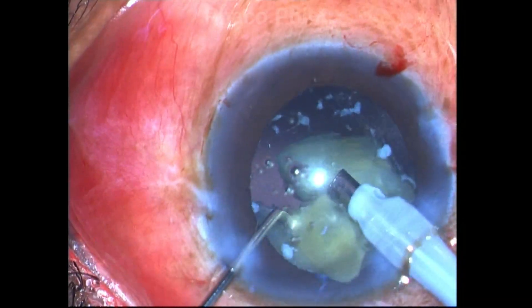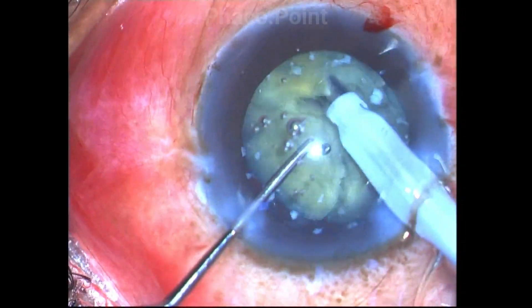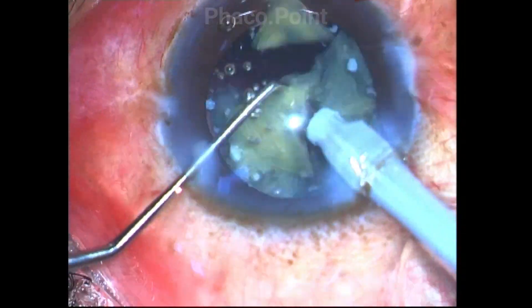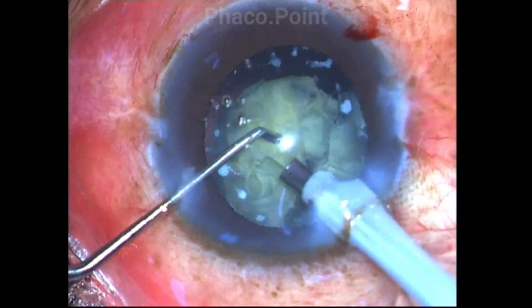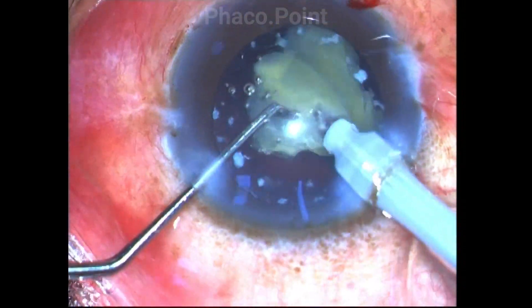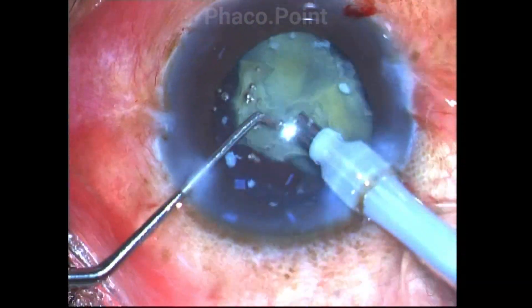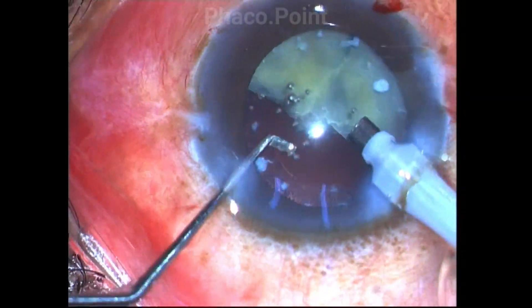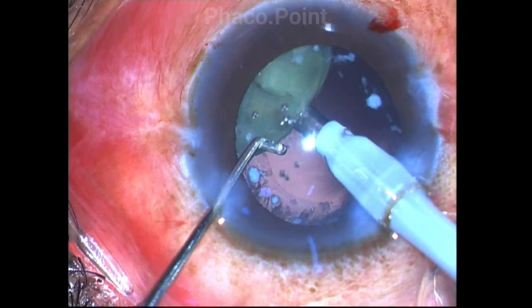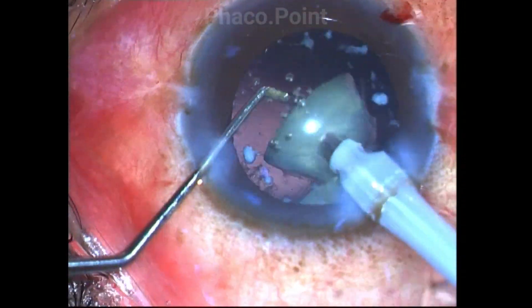Once I have made small enough fragments, even though they seem to be connected, it is still possible to emulsify these fragments safely within the safe zone. Every step and every move should be done with care and caution because inadvertent use of phaco power will cause damage to the posterior capsule. Wait for the nuclear fragments to follow the phaco tip, wait for occlusion to happen gently, and only then apply small bursts of phaco power to emulsify the nucleus.